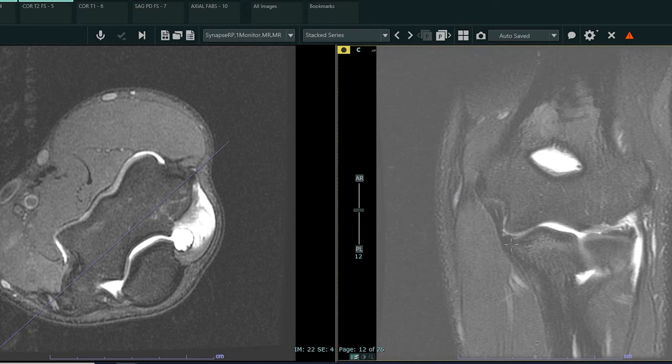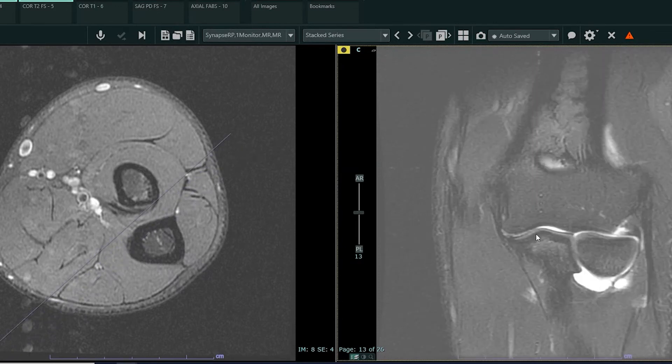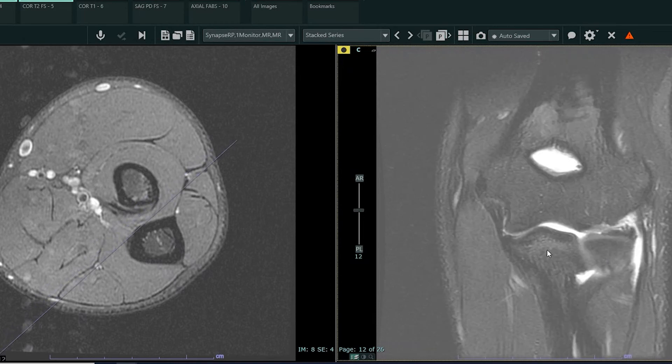In this case, the concern was for an ulnar collateral ligament tear. So some anatomy: this is a coronal image. We're looking more proximal or superior towards the patient's shoulder here, and more distal towards the forearm here. Here's the elbow — the ulnar humeral joint, the radiocapital joint, the proximal radio ulnar joint. These are the joints of the elbow, and the reason we were doing this study was to look for an ulnar collateral ligament tear.